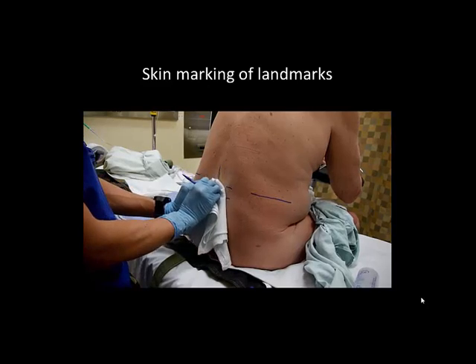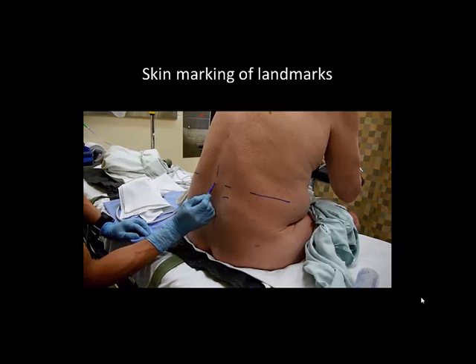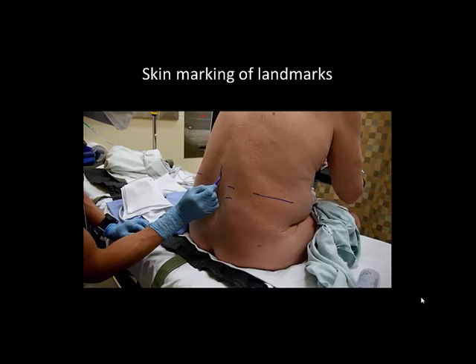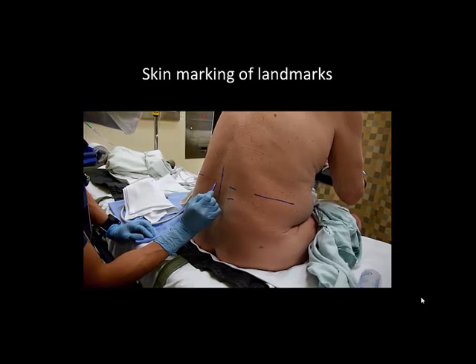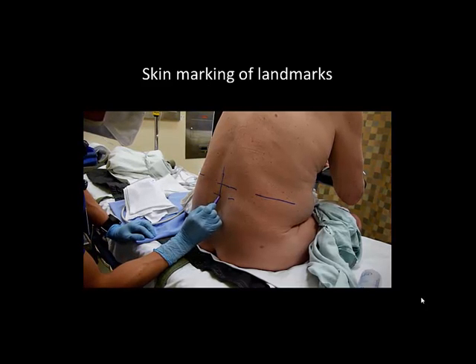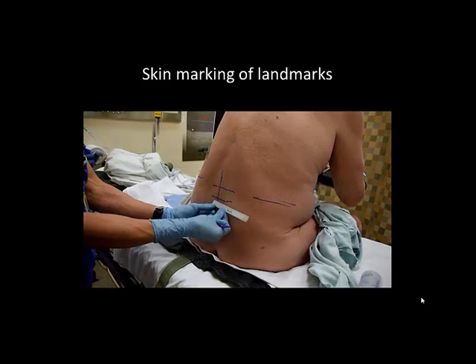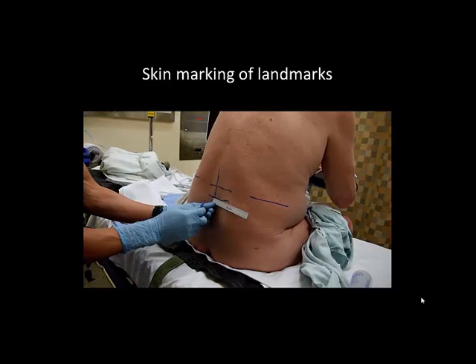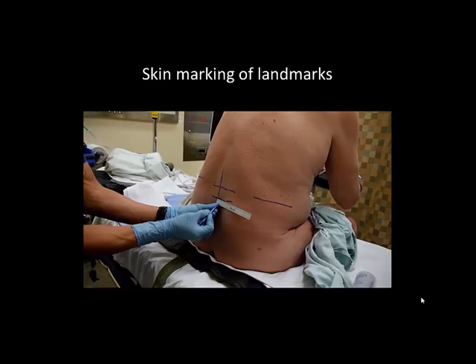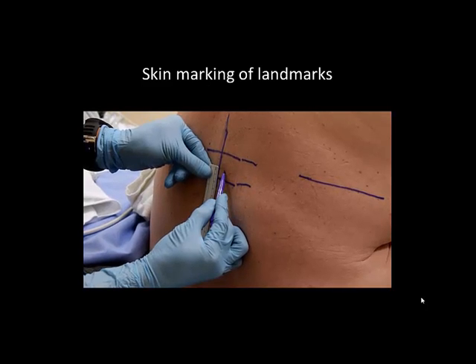Any remaining gel is wiped off and the marks are then extended to intersect. The intersection of these two marks indicates the location of the tip of the spinous process. The appropriate needle insertion point is marked approximately one centimeter lateral to the neuraxial midline and one centimeter superior to the line of the lower spinous process.